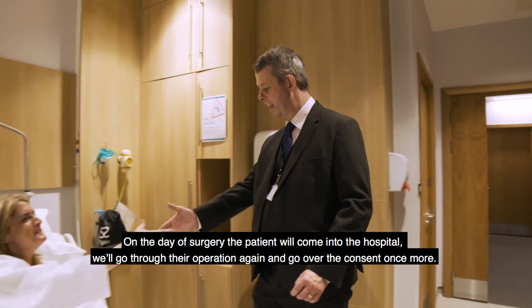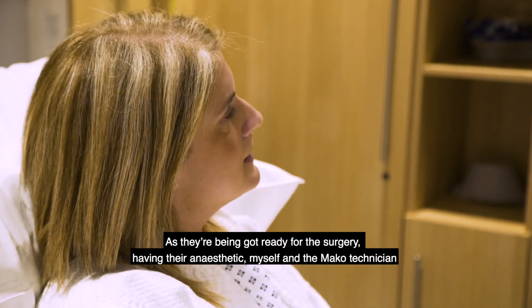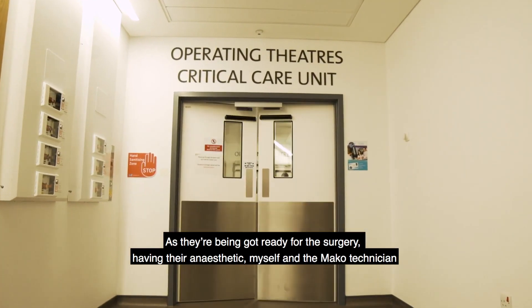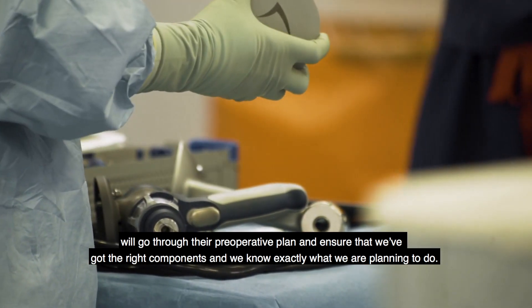On the day of surgery the patient will come into the hospital, we'll go through their operation again and go over the consent once more. Then as they're being prepared for surgery and having their anesthetic, myself and the Mako technician will go through their pre-operative plan and ensure that we've got the right components and know exactly what we're planning to do.